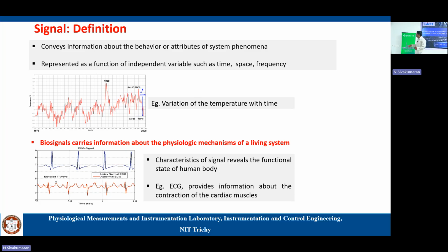So here, as far as this is concerned, we are interested in EMG. A signal, as you said, conveys information. But most of the time, whatever signal we record, the information will be buried.